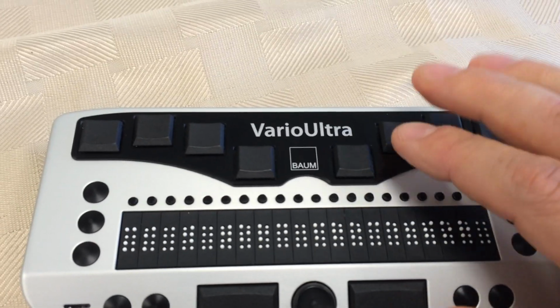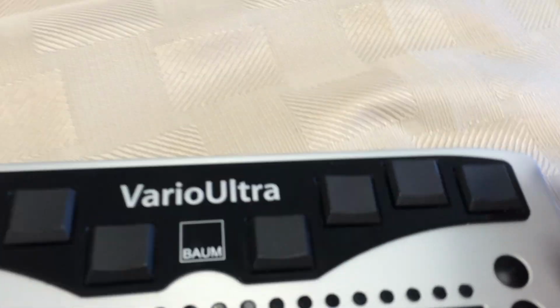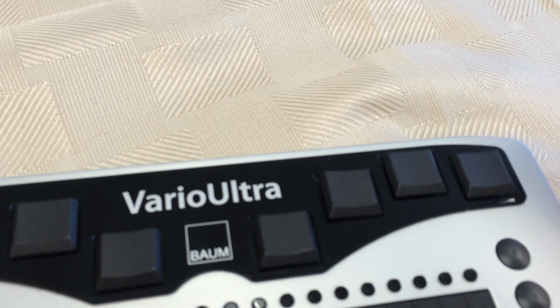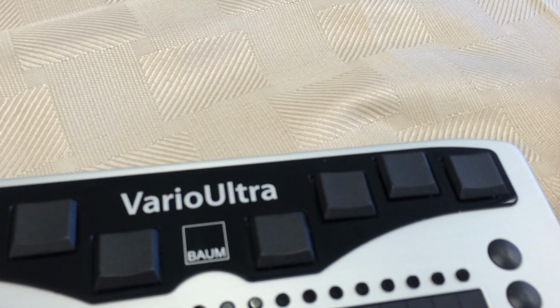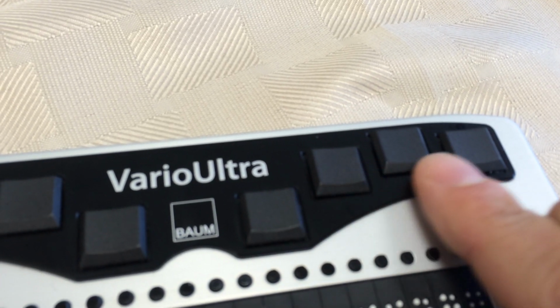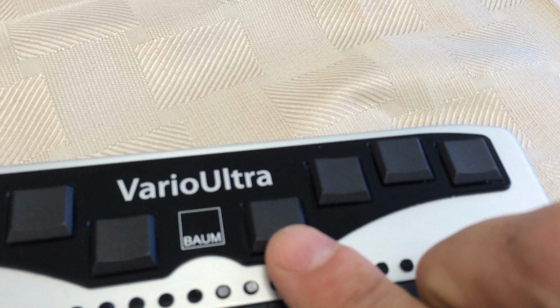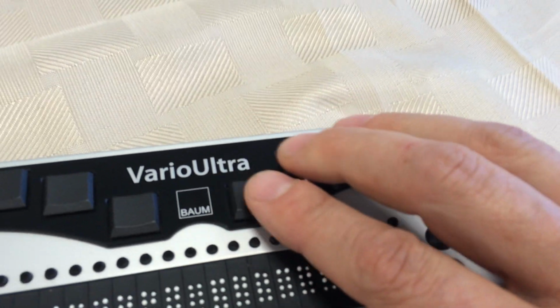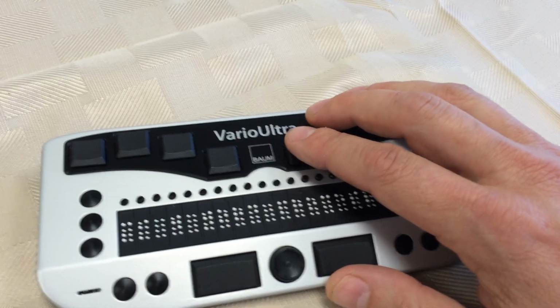The device itself, so let's describe it. The keyboard is laid out very ergonomically. What I mean by that is that when you place your hands on, let's say, a Perkins Braille, your fingers are going to be parallel to each other at all times. The design of VarioUltra, though, is such that the Braille keys are at a curved angle.